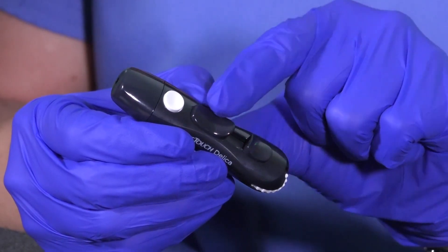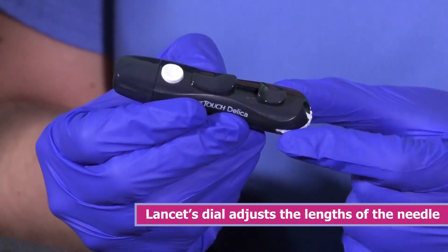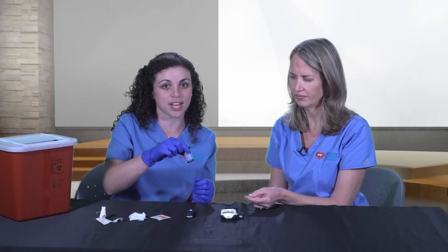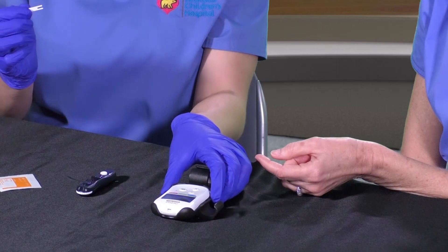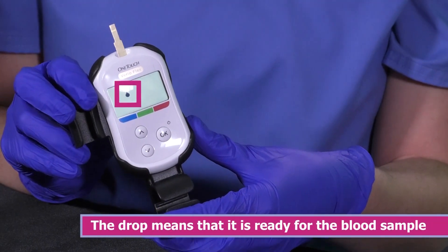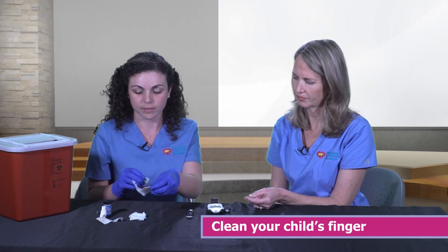This lancet has a slider button — now it's ready. Lancets also have dials with numbers, sometimes at the back or front, and it rotates. The smaller the number on your dial, the less deep your needle stick is; the larger the number, the more deep your needle stick is. Now your lancet device is ready. Next, get your glucometer ready by grabbing your test strips, removing one, and loading it onto your glucometer. This will make your glucometer turn on. Once it shows a drop, it means it is ready to receive the blood sample.